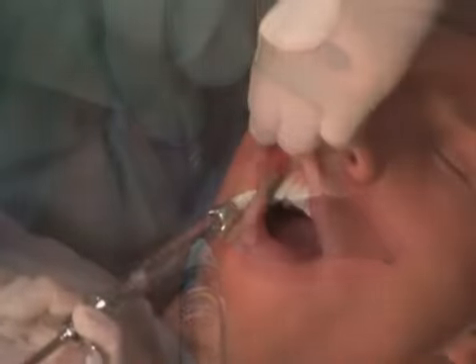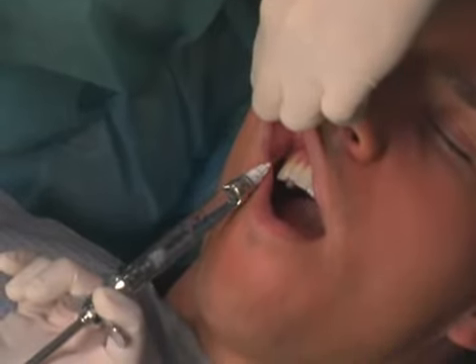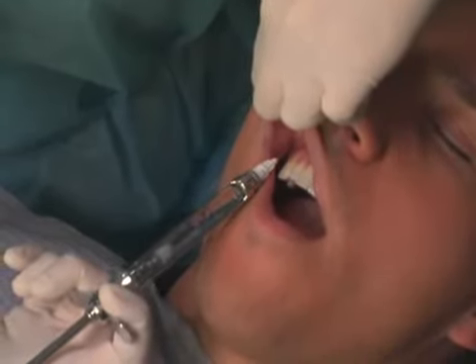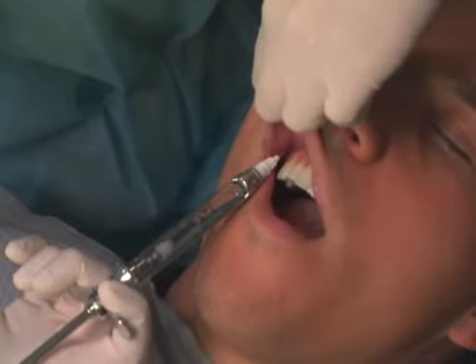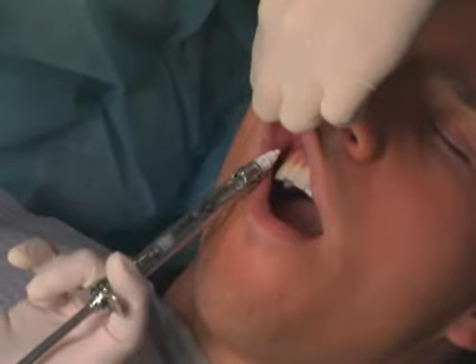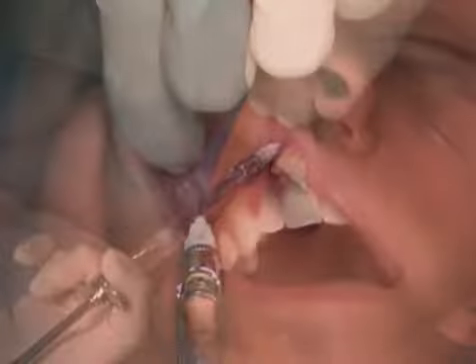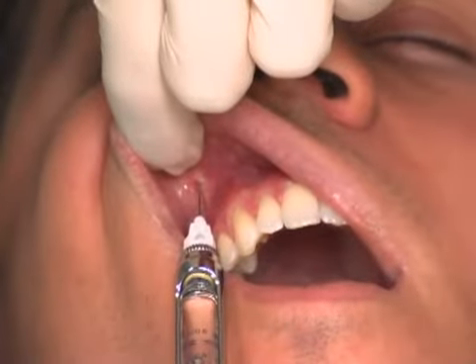The needle is held parallel to the maxillary bone and inserted until bone is contacted at the roof of the infraorbital foramen. After 2 negative aspirations, 1/2 to 2/3 of a cartridge of local anesthetic is deposited over 30 to 40 seconds.